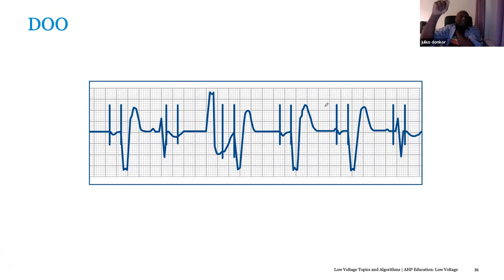Eventually they tend to program them to VVI pacing, usually when somebody's really old, and single chamber pacing will be adequate for their cardiac output and circulation, for them to get about and things. But yes, Medtronic call it a single pass lead. I've sent one to Dr. Duffy, he should have one.